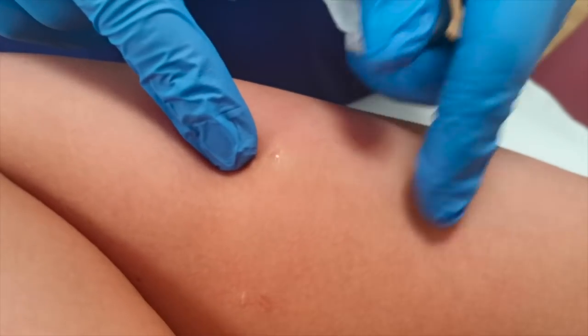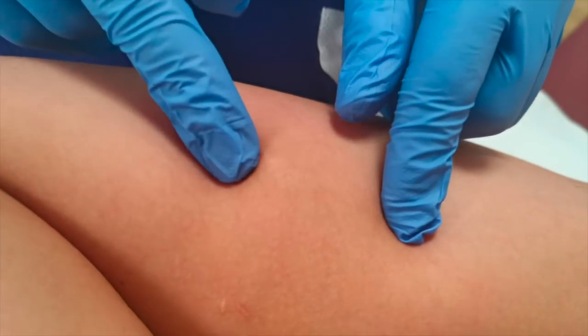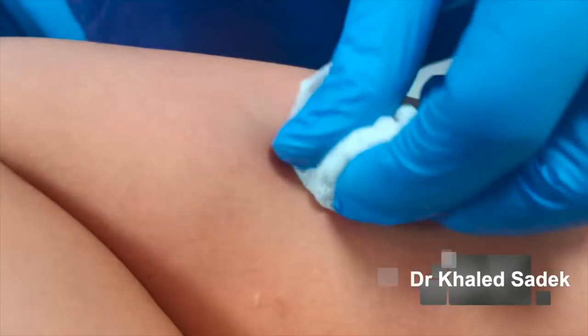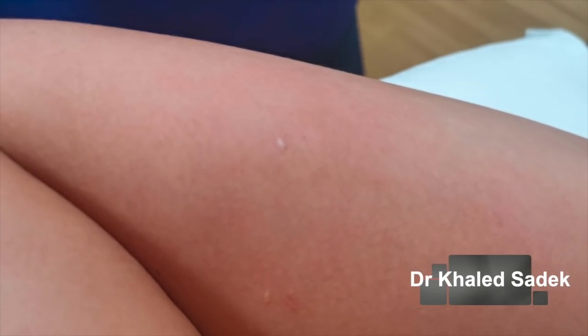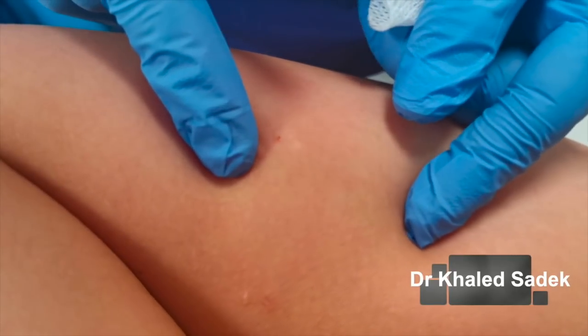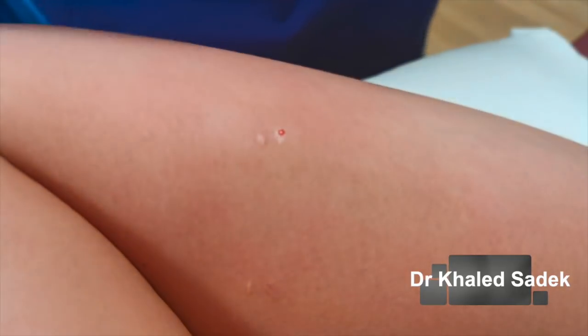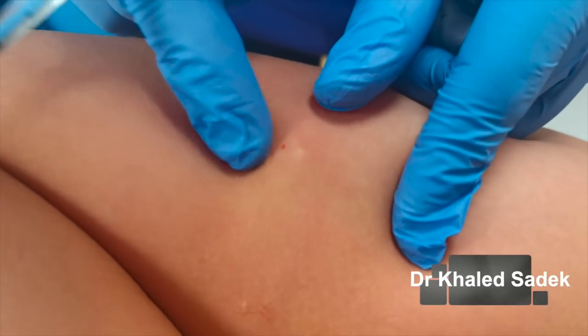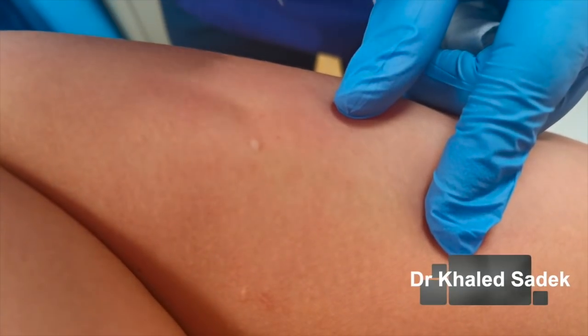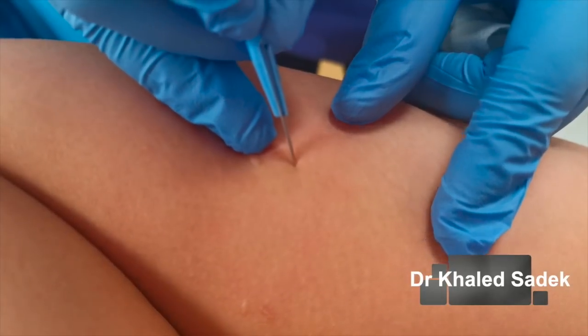As you can see, the anaesthetic volume displaces the implant head that we saw previously, but we can just see it coming through there. That looks fine. Okay, so let's take a look at our markings. We can see it just coming to the surface there. So we'll make a small cut and then we will bring the implant to the surface. This is a Nexplanon. Okay, so make a small incision just here.